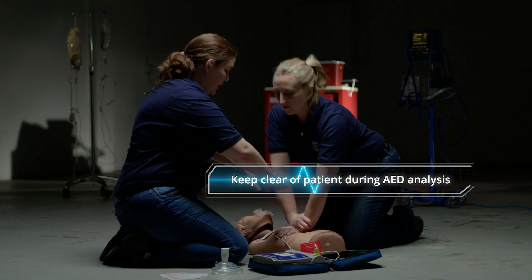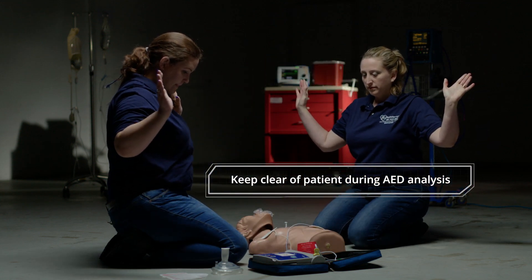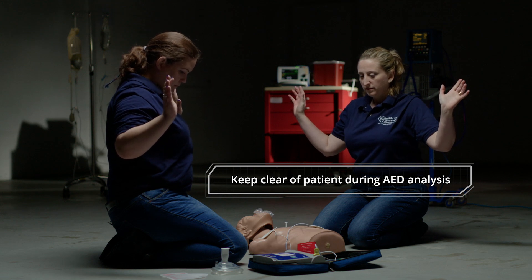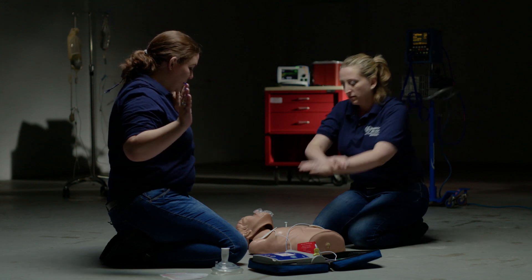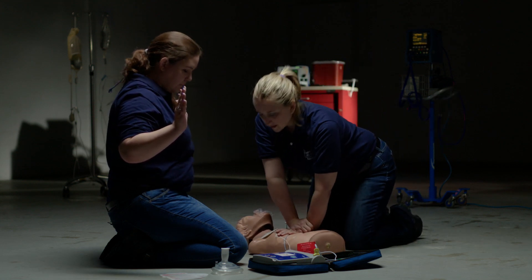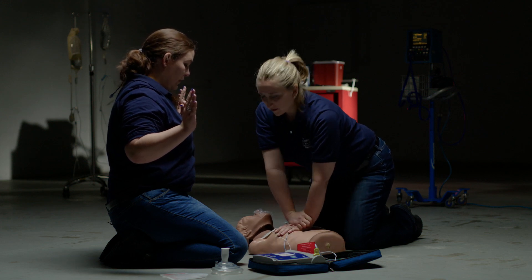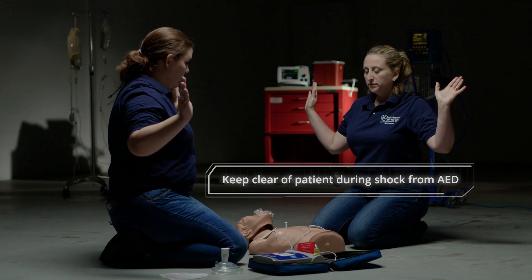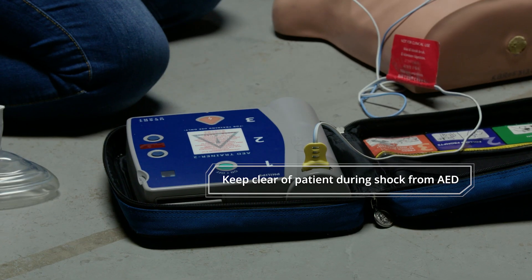Analyzing heart rhythm. Clear the patient. I'm clear. Do not touch the patient. Shock advised. Resume compressions, please. One, two, three, four, five, six, seven, eight, nine, 30. Deliver shock now. Clear the patient. Press the shock button now. I'm clear. You're clear. I'm clear. Shock delivered.